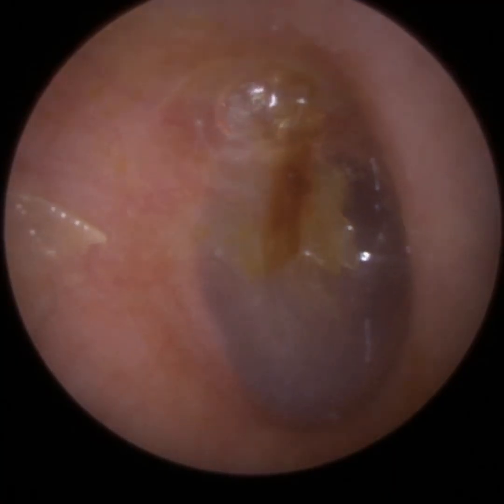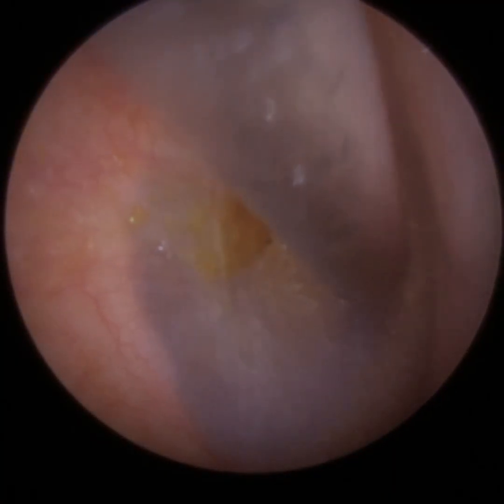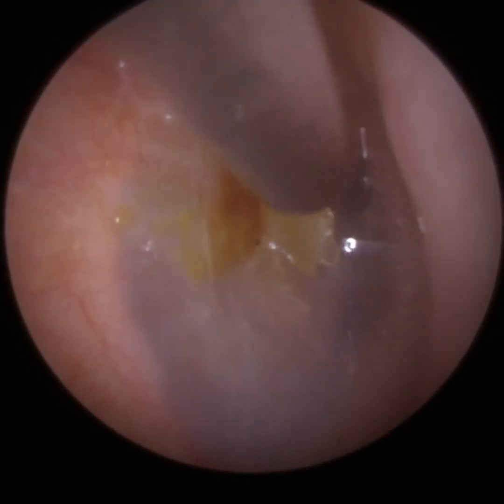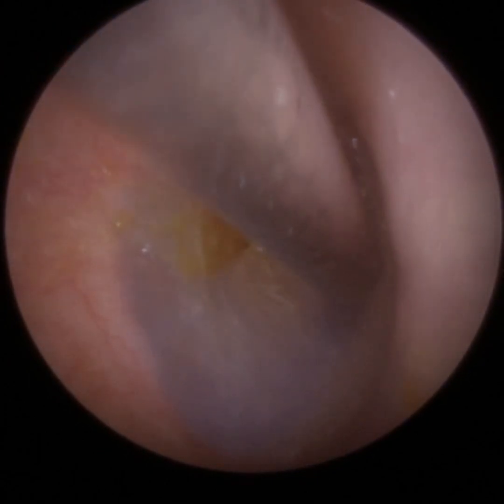And so the hammer bone is connected to the eardrum, the first bone. You can see this is the bit of crusted skin just on the hammer bone, and that's a very sensitive part of the eardrum. So I've decided just to leave that. I'm happy I can see the whole eardrum now. You can see the blue tinge, whereas before you couldn't. It was an oxidized layer of skin.